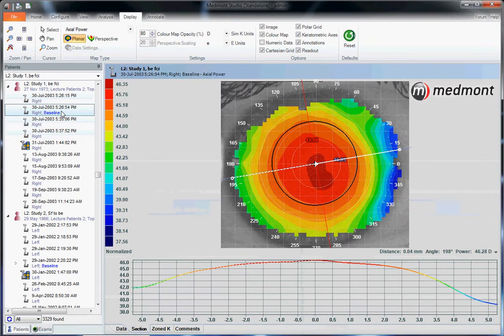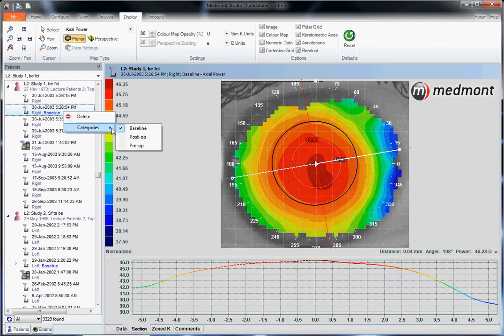In this case we chose the second image and we labeled it baseline by right-clicking, going to categories, and selecting baseline. We highlight this as being the pre-orthokeratology map that we're going to use to compare against all future visits.